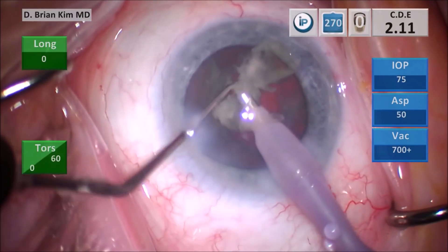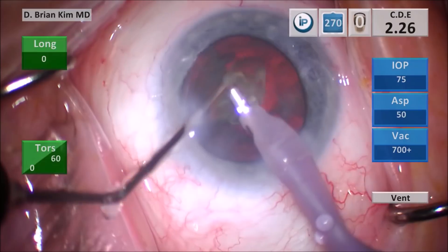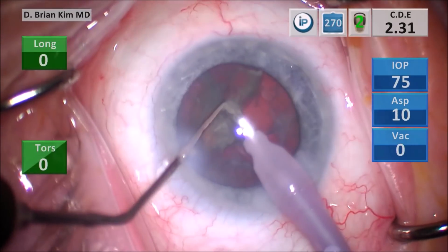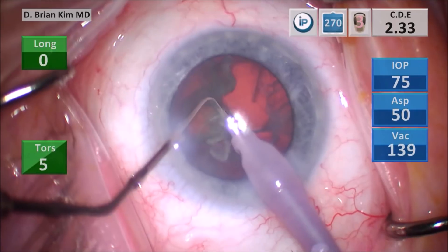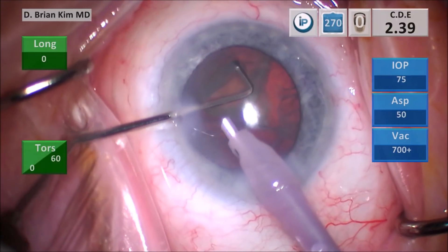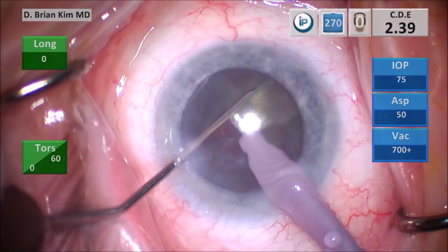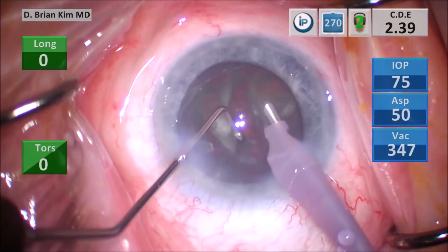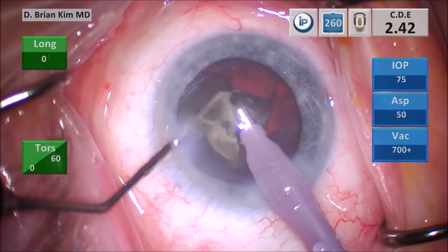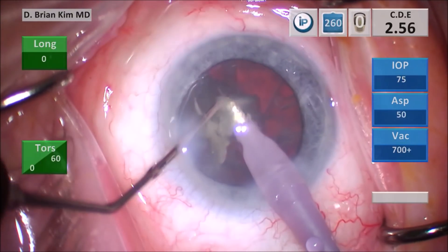I'm keeping the instruments always in the central safe zone. I try not to go and fish for pieces, and by doing so, this has really reduced my chances for complications. I'm emulsifying the lens material here little by little, taking my time and pulsing as I go. For this last quadrant, it's the same maneuver: pronating, making sure I'm under the anterior capsule, supinating to correct position. The phaco tip is deep. I'm using the phaco tip to guide where I'm going to crush, then I bring the instruments together, crush the lens, use a little bit of vacuum to redirect the lens at my tip, and keep crushing as I go, then pulse ultrasonic energy and vacuum to remove the lens material. The pulsing of ultrasonic energy and vacuum only occurs after I'm ready to emulsify the pieces.